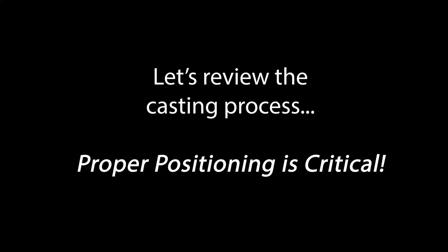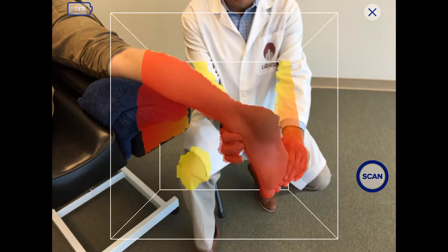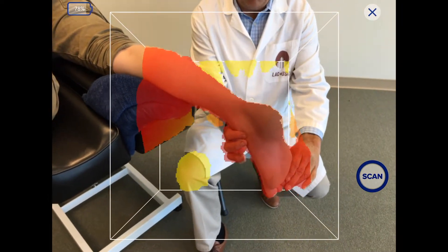Let's review the casting process. Proper positioning is critical: placing the patient's foot in subtalar neutral, loading the mid-tarsal joint, and plantar flexing the first ray.